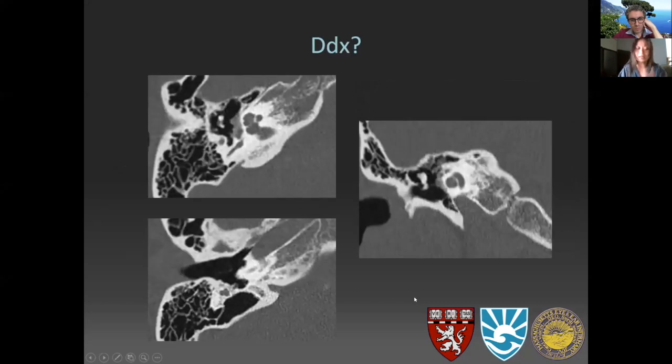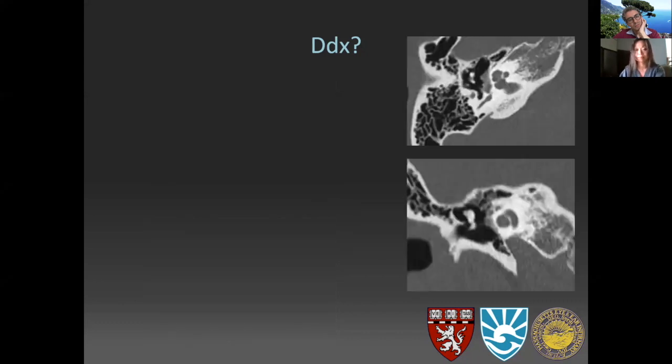So what is the differential diagnosis? Well, we already mentioned one thing, which is otospongiosis, so that's certainly a consideration. It can expand and thicken bone towards the sclerotic phase, so that's okay. You would like for it to conform to the embryology of the otic capsule, where there's an outer layer that's not affected, although that's microscopic, but we should think about some other things. So let's take a look.